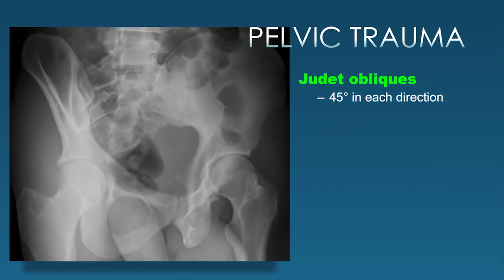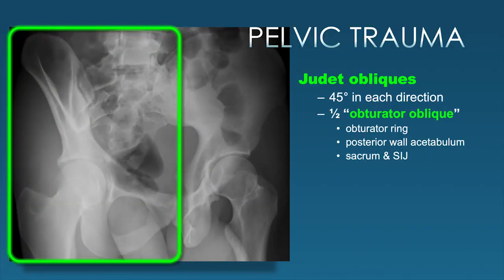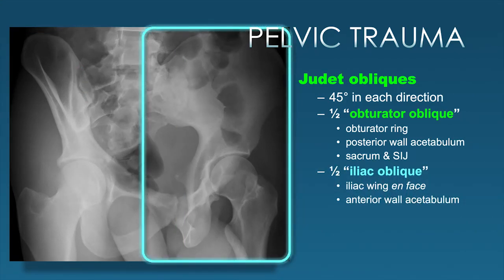The oblique views, or Judet views, are roughly 45 degrees in each direction. Each oblique view has two images. One half is referred to as the obturator oblique because we see the obturator ring coming right at us; from this view we can see the posterior wall of the acetabulum as well as the sacrum and SI joint. The other half is the iliac oblique because we see the iliac wing facing us, allowing visualization of the anterior wall of the acetabulum.